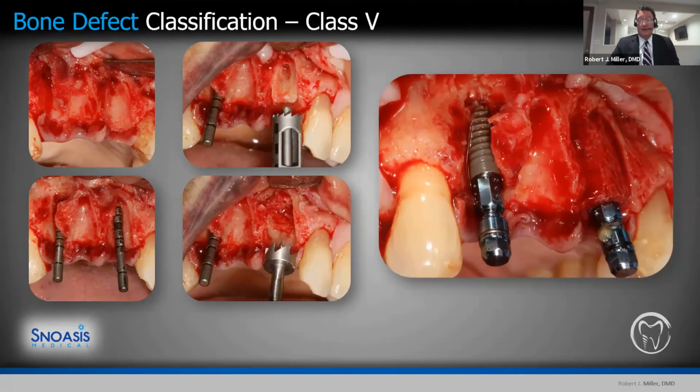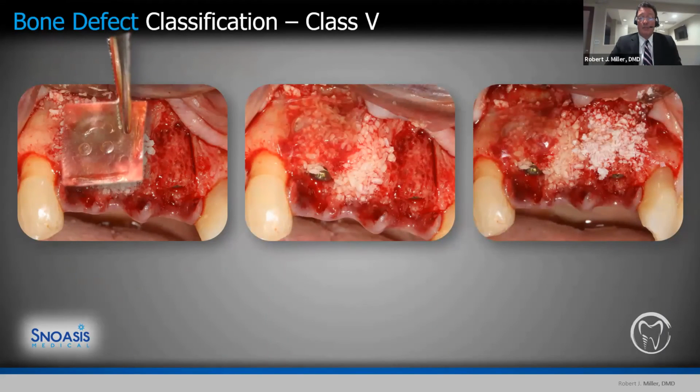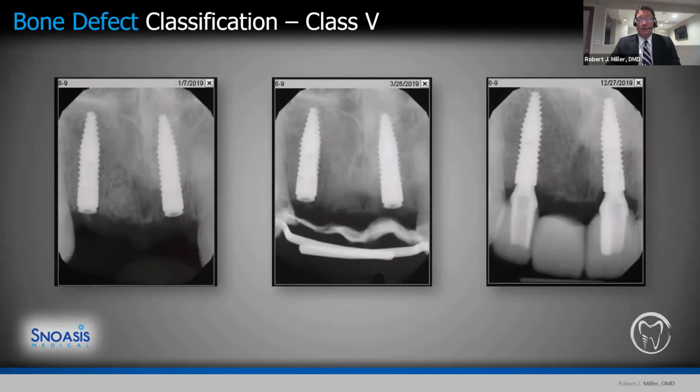Now, in position number 7, I opted to place the implant immediately. And again, we have a substantial amount of threads exposed here. And I consider this either a class 4, class 5 type defect. And so we opted to treat number 7 using the BioXclude. Number 9, we were going to use the bone ring treatment protocol. And so in position number 7, we used our freeze-dried bone allograft and our BioXclude membrane on top of that. Position number 9, the treatment protocol calls for a xenograft with a collagen membrane on top of that. I typically use the healing cap or the fixation screws to retain the collagen membranes. Closed over, allowed this to heal.